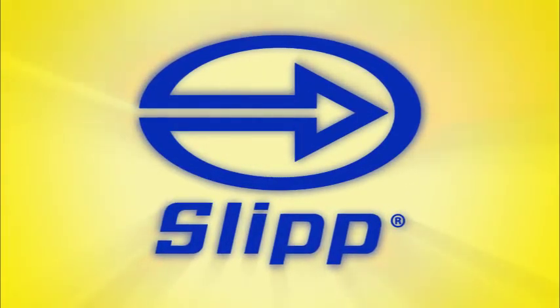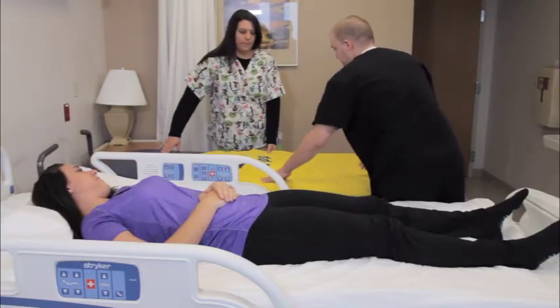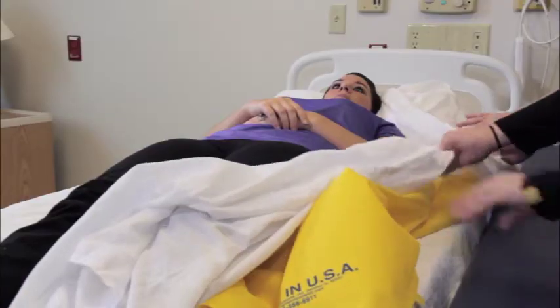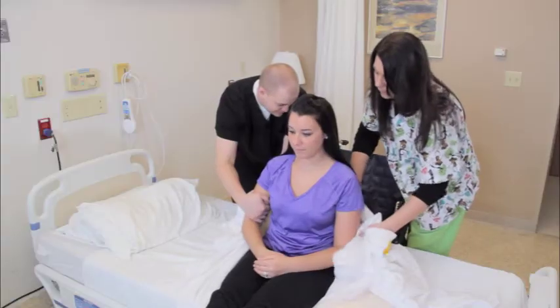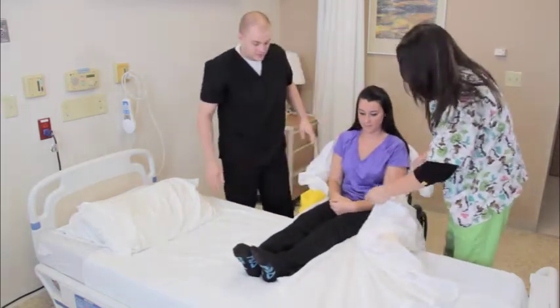Slip, the patient mover. Slip is a unique patient moving device which makes transfers and repositioning easier than ever before on both the patient and caregiver. Unlike other patient moving devices, Slip's unique design lets the patient, regardless of weight, literally slip on a comfortable surface of sealed fluid that reduces normal friction to a minimum.